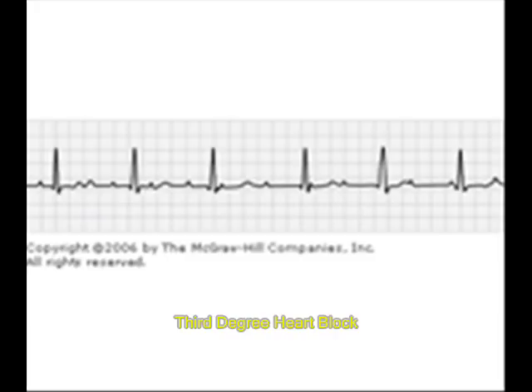And now in this EKG you can see a third degree block. Both atria and ventricles contract independently and differently. This is third degree AV block.